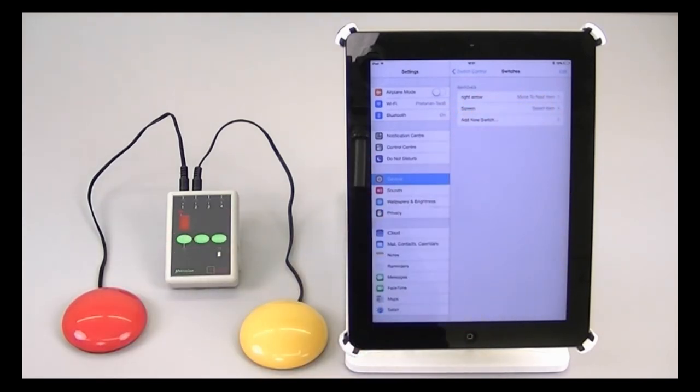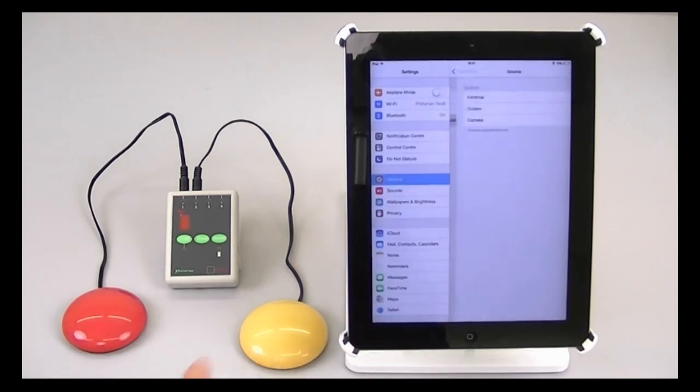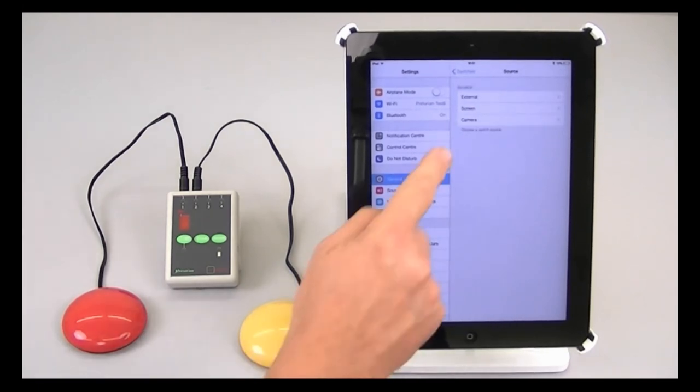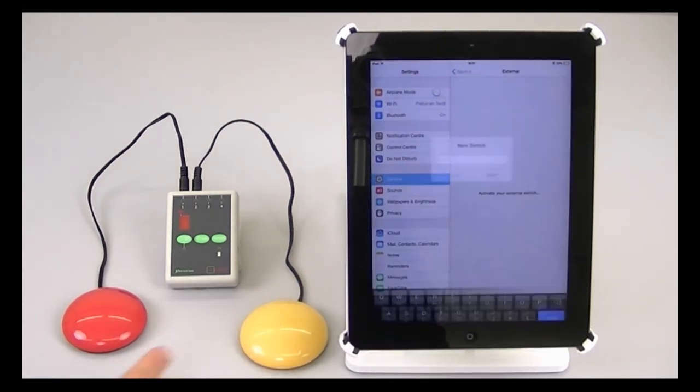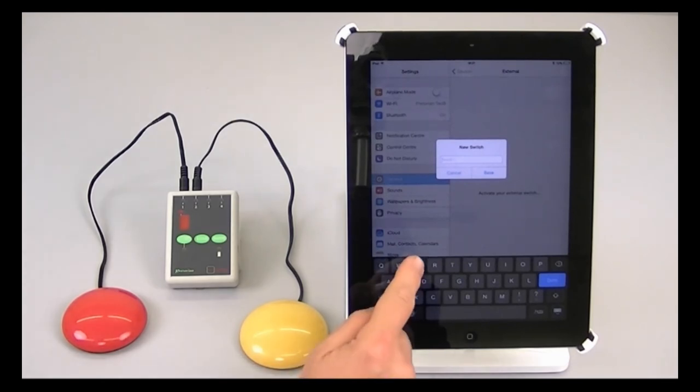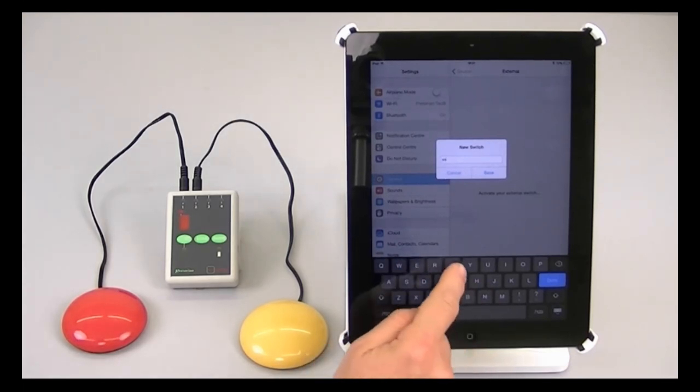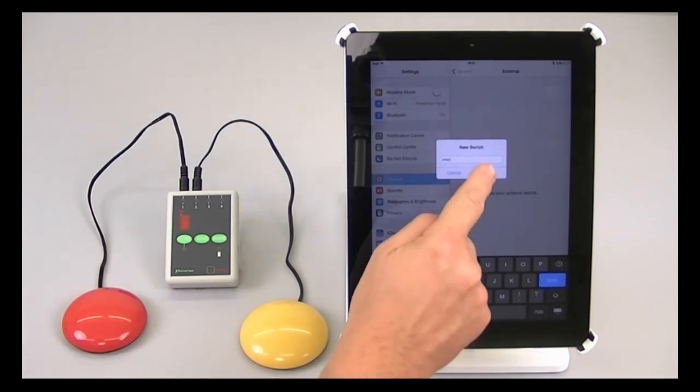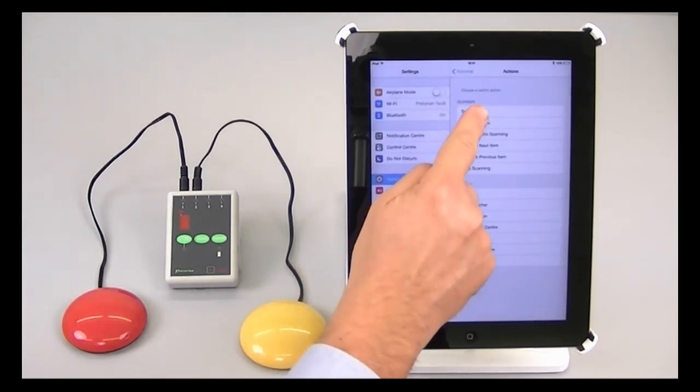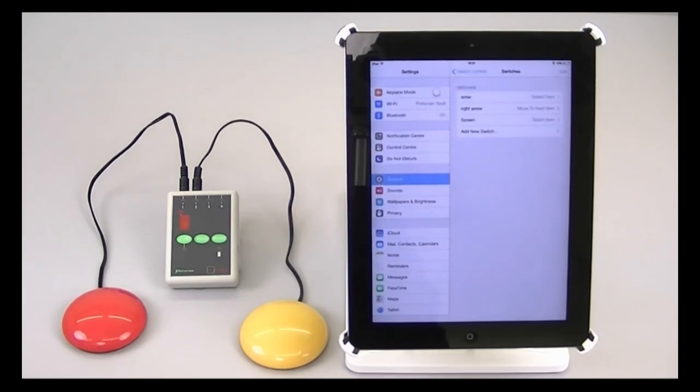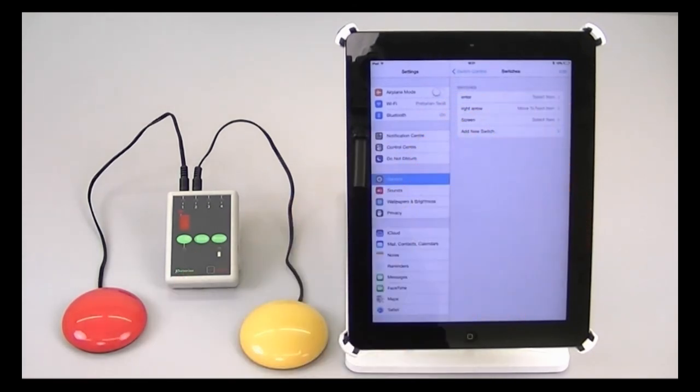I'm now going to do more or less the same thing with the yellow switch, which we want to be select item. So add a new switch, external, tap that switch, it asks for a name, I'm going to call it enter. And now allocate a function to that switch, which is select item, and now you'll see enter is set to select item.